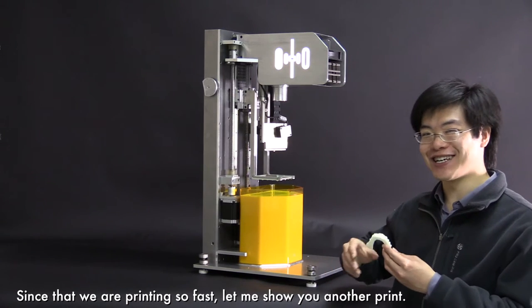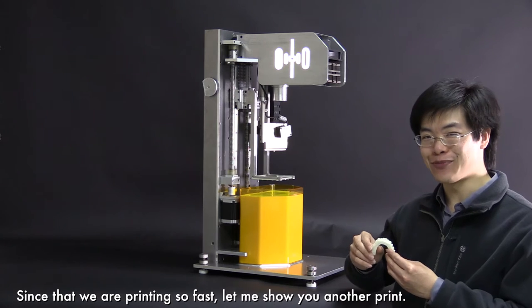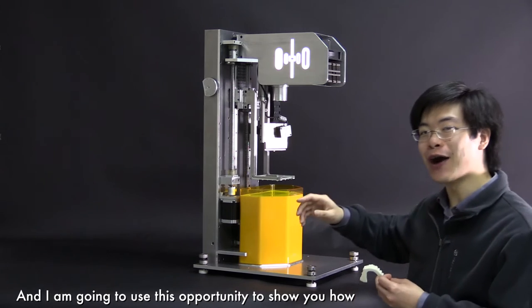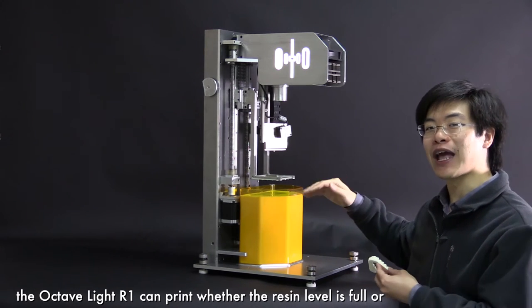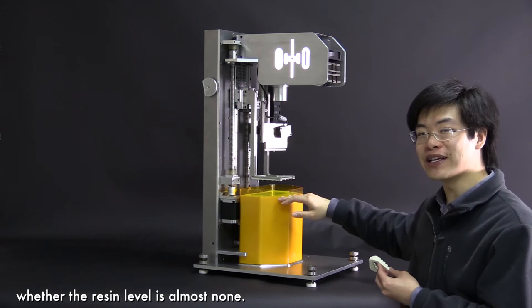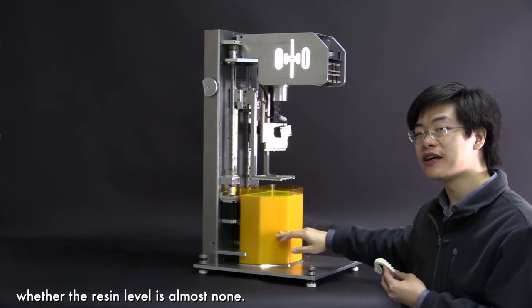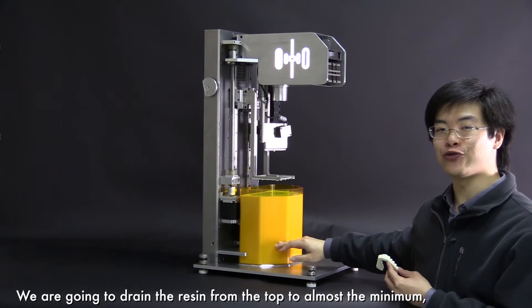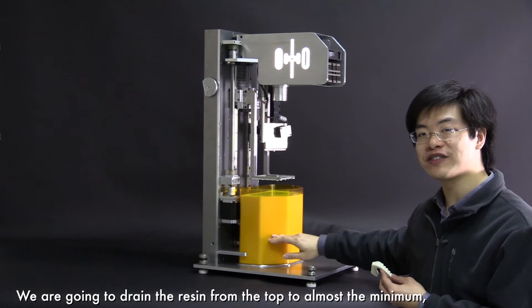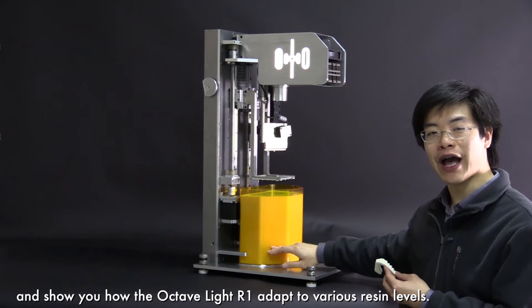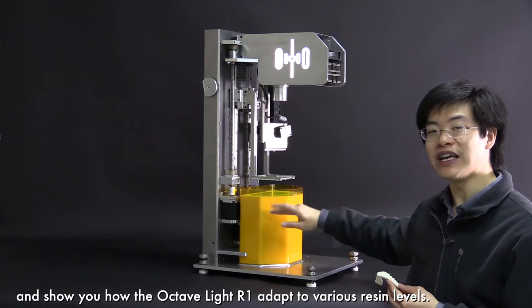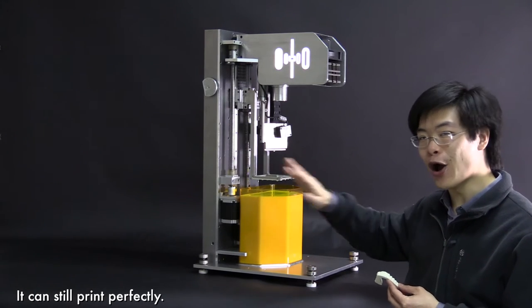Since we are printing so fast, let me show you another print. And I'm going to use this opportunity to show you how the Octav Light R1 can print whether the resin level is full or whether the resin level is almost none. We are going to drain the resin from the top to almost the minimum and show you how the Octav Light R1 can adapt to various resin levels. It can still print perfectly.